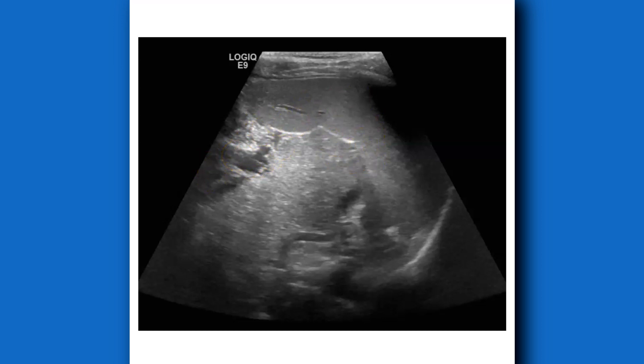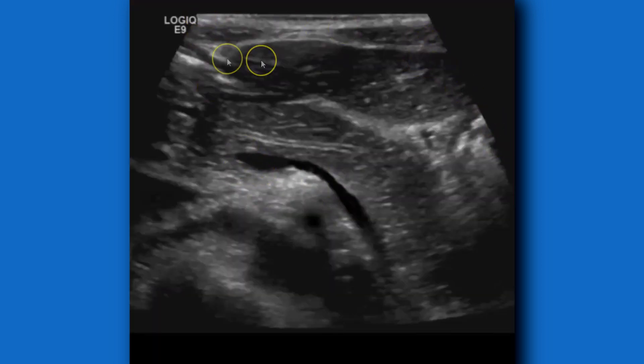This is a transverse view; the previous was a sagittal view. Here's another view using the linear 9L for the GE machine — again a slender patient, so I can use the linear probe. On larger or obese patients you won't be able to use it, but you can see the pancreatic tail very clearly, and the splenic vein, which is the portal-splenic confluence. The splenic vein goes up into the portal vein and then into the liver. Angling below you have the SMV, SMA, aorta, and IVC — those four vessels are good for ruling out malrotation.